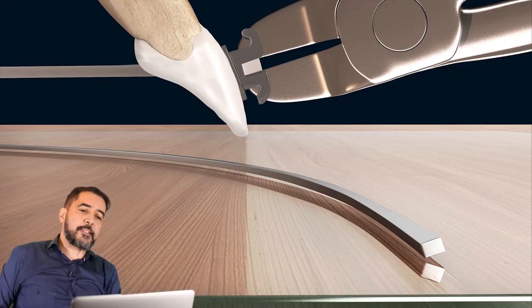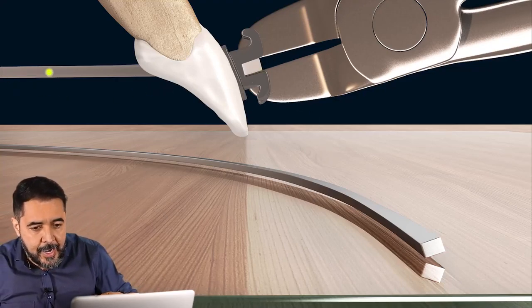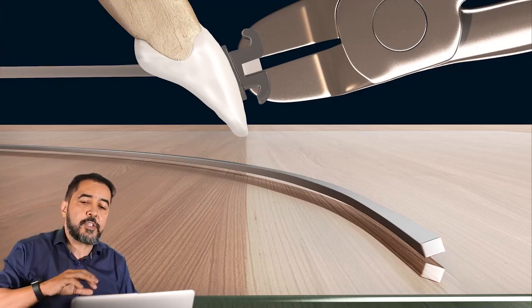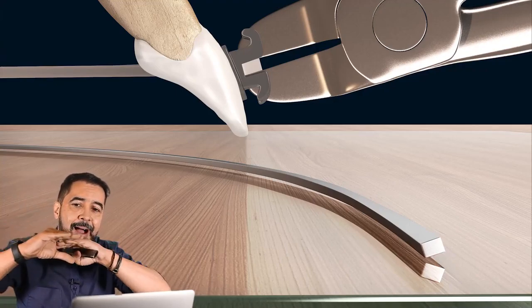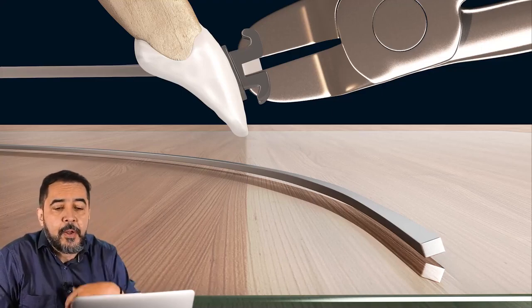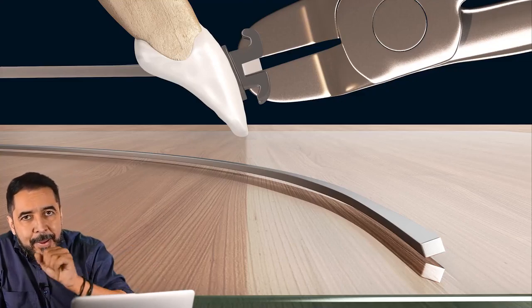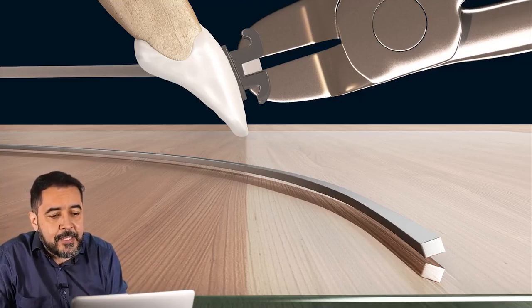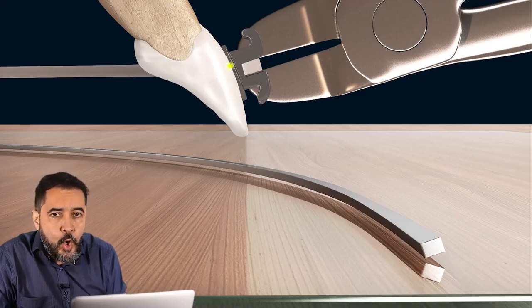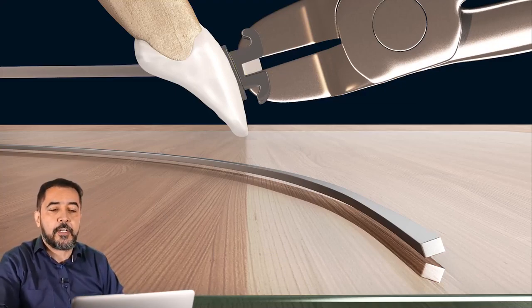So as you can see, when I insert it inside the slot, the posterior segment at the end of our arch wire is going to pass at the same height, at the same level of our tubes, of our premolars and canines brackets. So it's a passive relationship, and this slot won't generate a couple here because the inclination of the torsion is the same as the inclination of the slot.